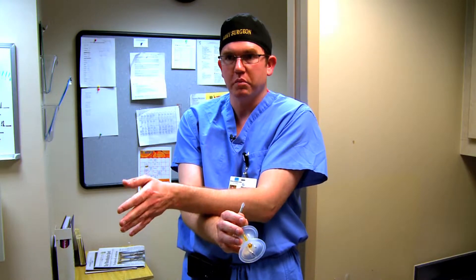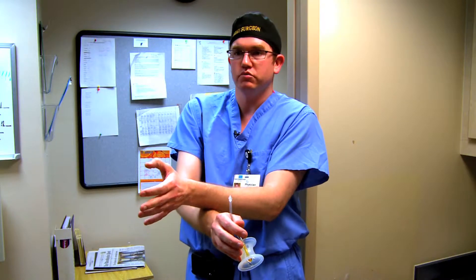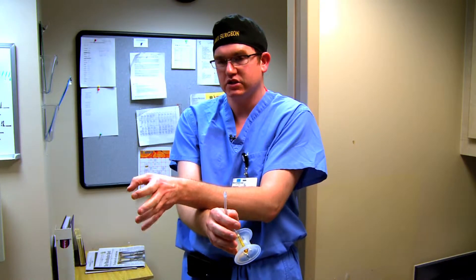With the da Vinci robot, that challenge is taken out of the equation. The programming and software of the da Vinci takes into account that when you move your right hand, it moves your right-sided instrument — not your left. And when you move your left hand, it moves the left-sided instrument. That makes it a much more stable and much safer platform.